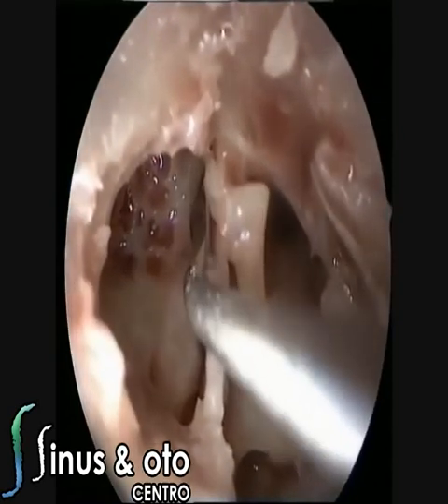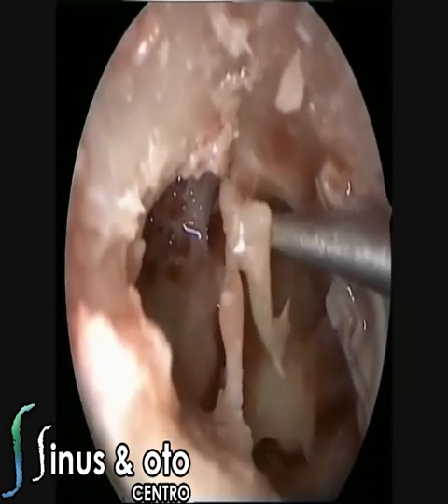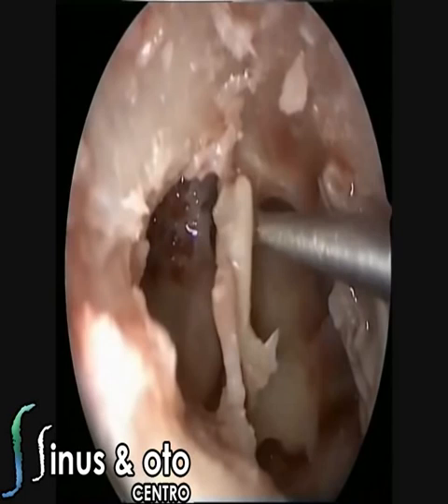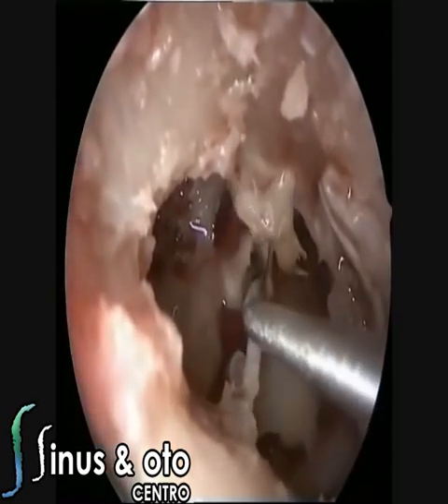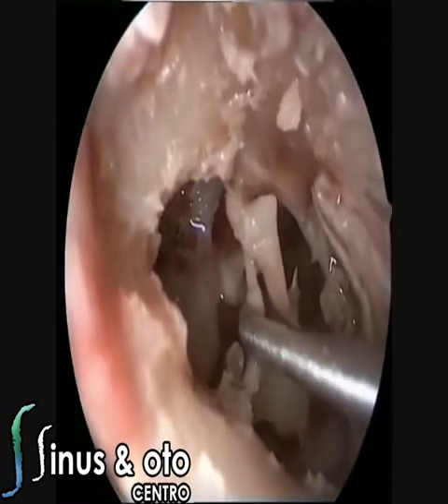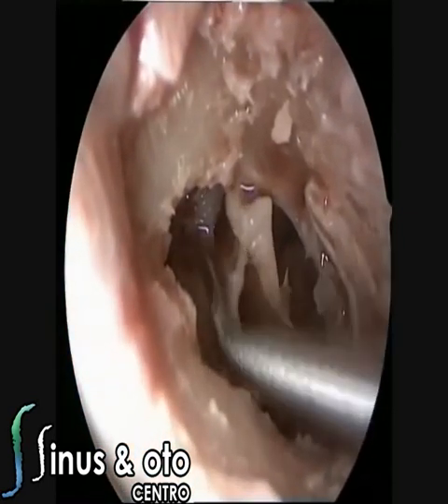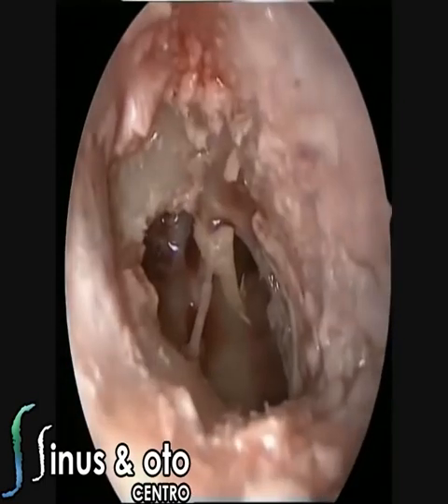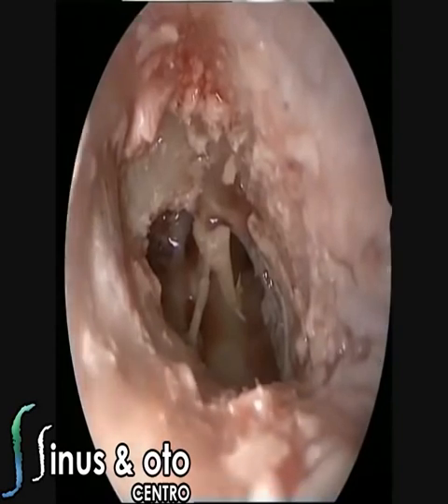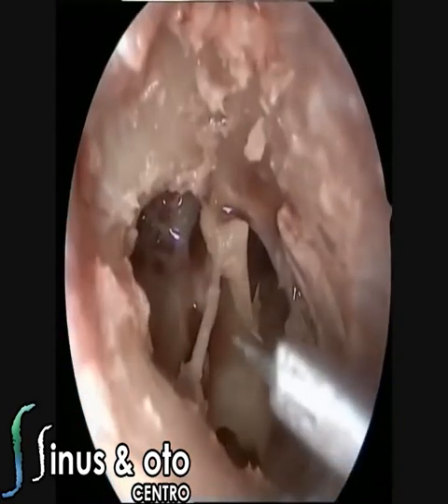The cog is the first anterior tympanic cell, so it's a very important landmark, and we are testing this ventilation route. Is it open, the anterior ventilation route? And as you can see, the mucosa is different. There is a difference of the mucosa from the supratubal recess and the anterior tympanic spaces. And also this difference is very important to understand the immunological and physiological concepts of the mucosa of the middle ear and the mastoid, of course.